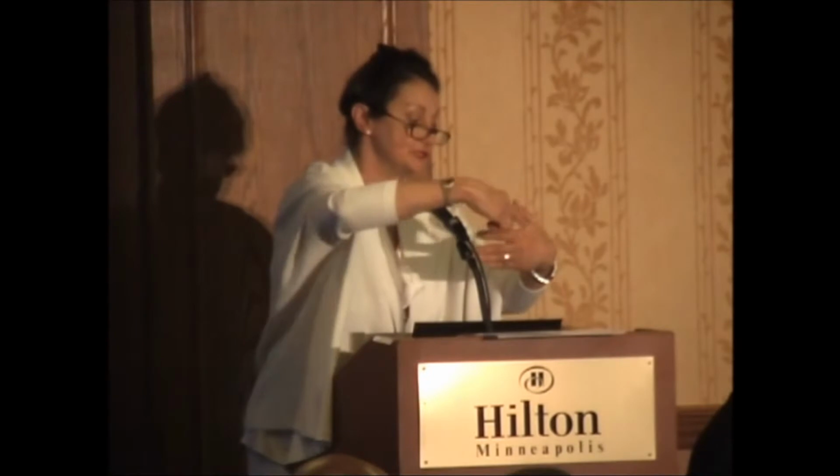Okay, so here's a RIMA to a ramus. And again, you first do the graft and you go, oh my goodness, PI 5.4, backward flow. I mean, the native flow is coming down, and here's the bypass, and it's just so torrential, it's going back up the graft. So that is what this little thing is. That's retrograde flow. So do the snare test, the flow goes up to 20, the PI goes down from 5.4 to 1.4, and at the end of the case, you've got a good pulsatility index, but the flow is a little on the low side, but that's because you've got competitive flow.